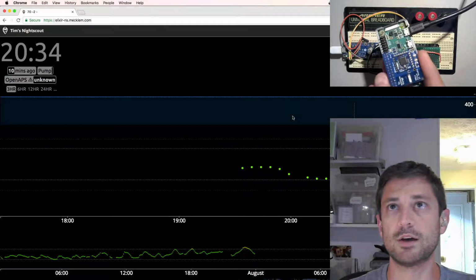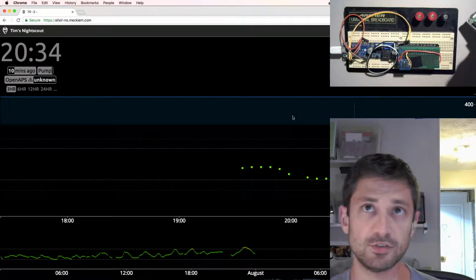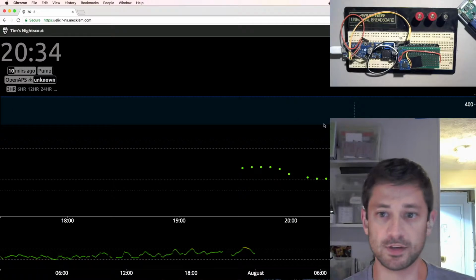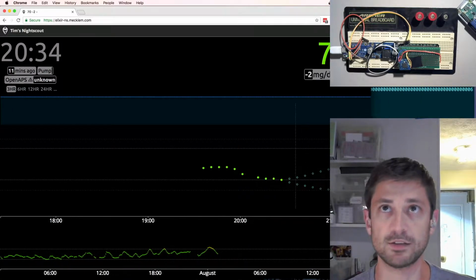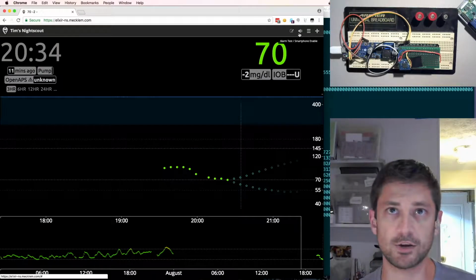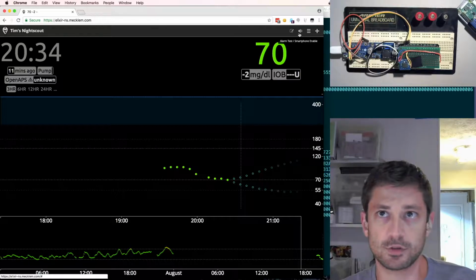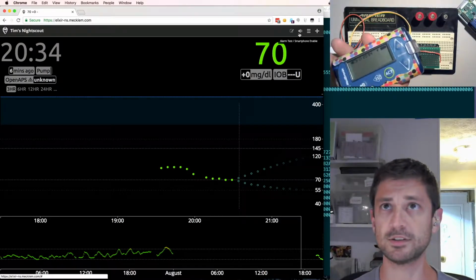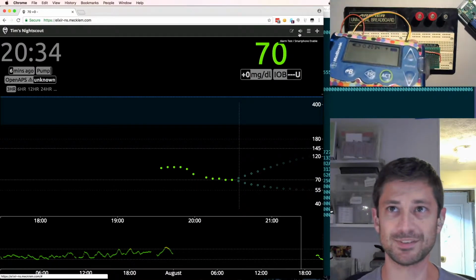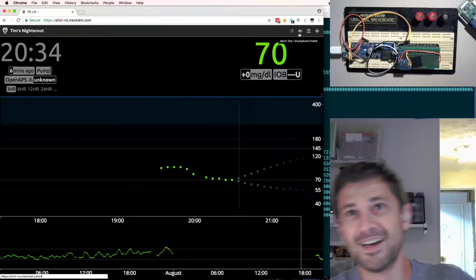And right now, every 5 minutes, it just wakes the pump up and communicates with it and says, hey, what's the CGM look like? Continuous glucose monitor. And then it pushes that data up into Night Scout. And I didn't write anything about this Night Scout app. It's all a node server that's running on the internet. It's really just aggregating this data and putting it out there so you can understand what the data points look like and what they mean. This is the Medtronic pump that I'm wearing right now. I'm not going to show you the CGM.